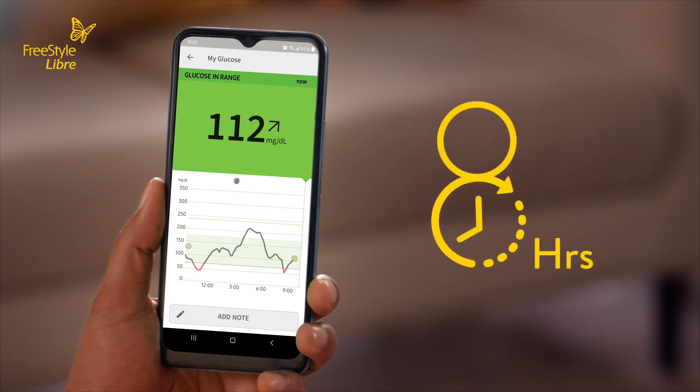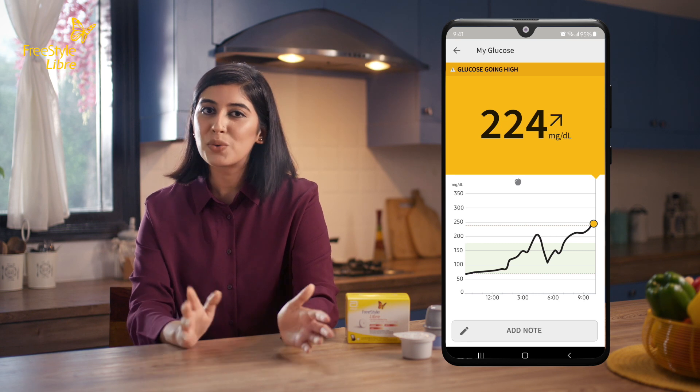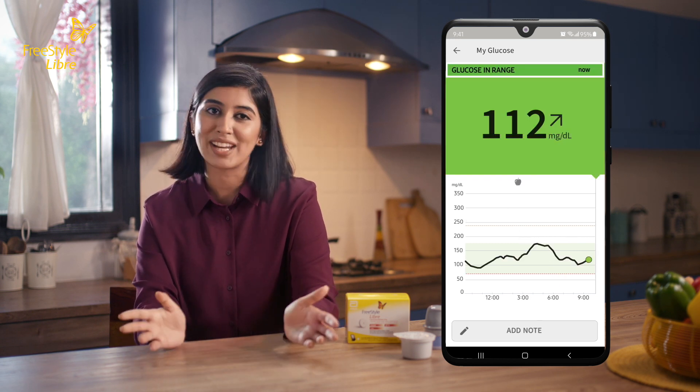8 hours later, you will see your first complete glucose graph. It also tells you how much time you are in or out of your target range, and helps you understand where your glucose levels have been. The final piece of information on the screen is your glucose message. A message may appear when glucose readings are high, low, or in range.